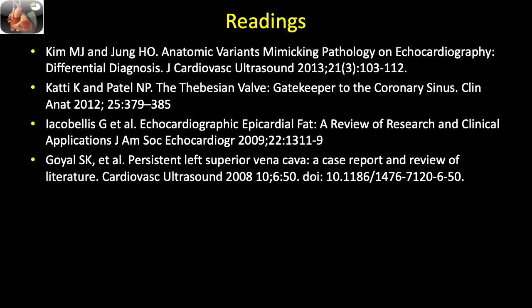Here are some useful readings associated with this topic. The coronary sinus. It is more common in patients with congenital heart disease.